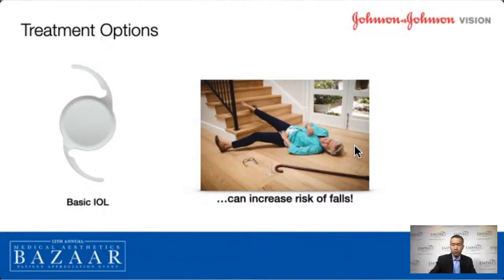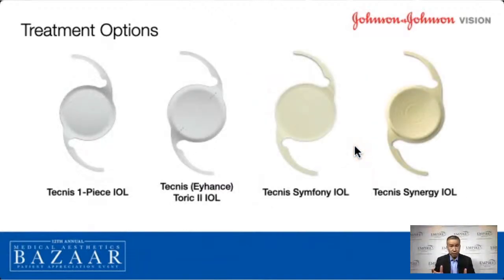So if we're doing lens surgery, and this is where we get into the lens implants, we have an option to build in that range correction, or to correct that presbyopia, with the lens implant. Without getting into too many details about different lens implants, because it can get confusing, when I take your lens out, when Dr. Gao takes your lens out, we replace it with an implant that not only can restore focus for distance, but it can restore it for many different ranges, including up close. So a lot of patients who are wearing glasses or bifocals or trifocals or progressives are not wearing glasses at all. Now, it's hard to say that we'll be able to get everybody out of glasses, but the goal is to reduce your need for them to as little as possible.